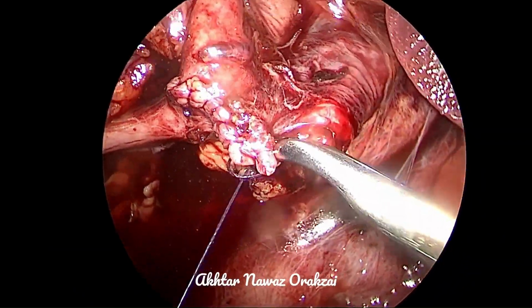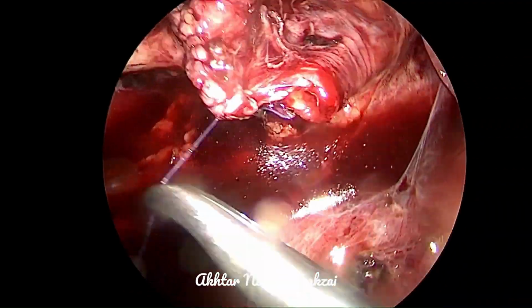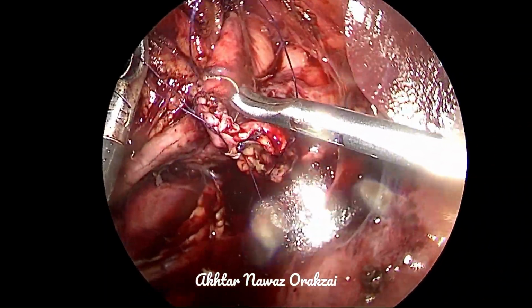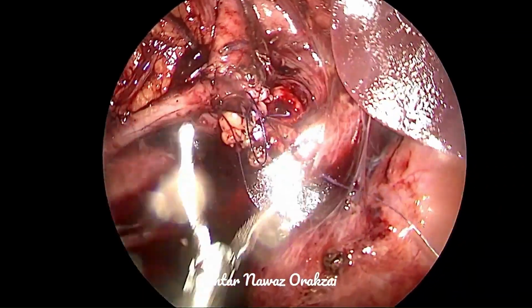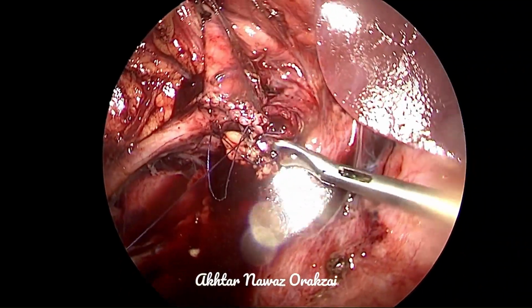However, we addressed it by spatulating the ureter a little more than the usual. So in this case, if there is any adynamic segment, it will go up towards the apex of the pelvic resection site or the anastomosis.